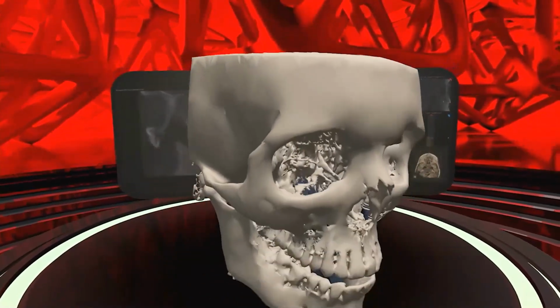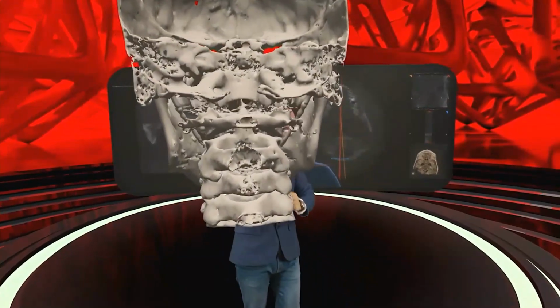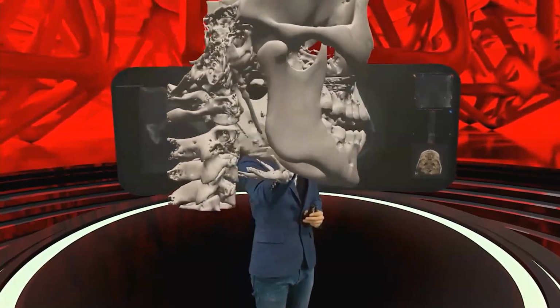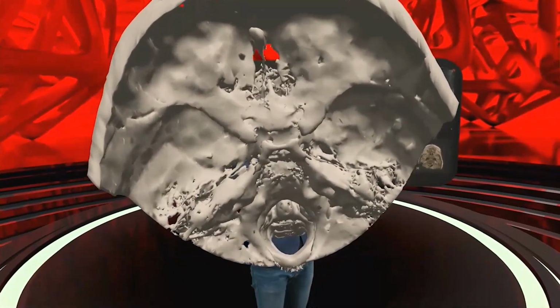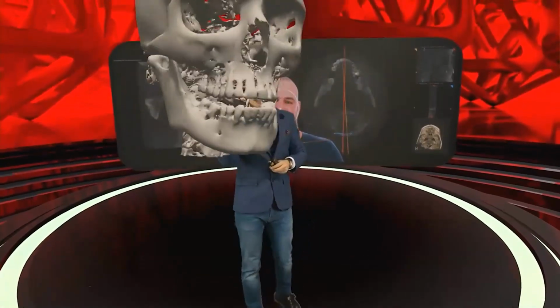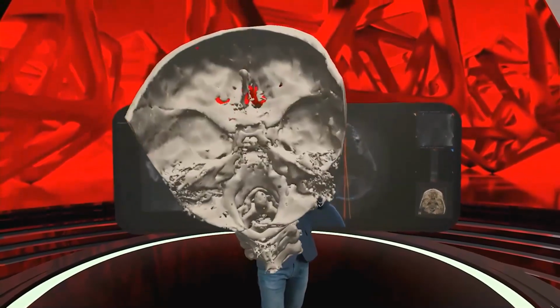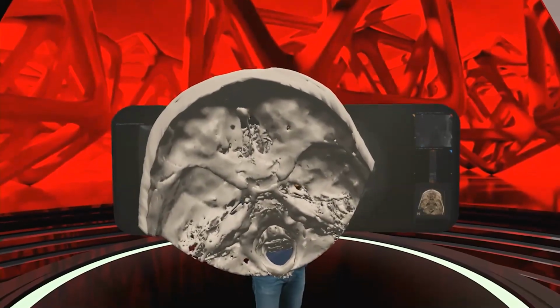So when we look at the skull, you look at the cervical vertebrae, and we can easily see the spaces between them. But you can also look inside your spinal cord, and you could notice if there is some rotation or not. By the way, this skull is made of CBCT. So this is exactly the skull of our patient, of our beautiful patient, right?